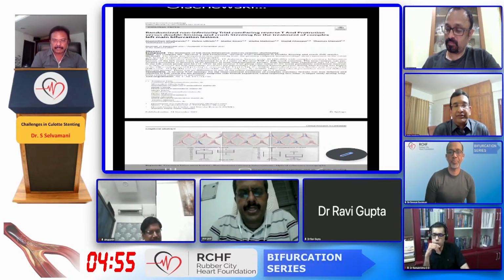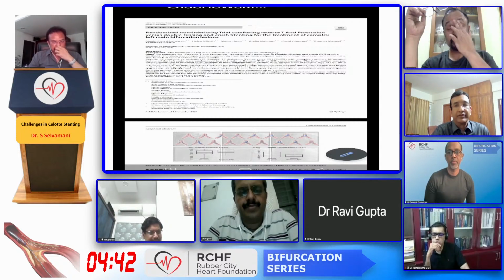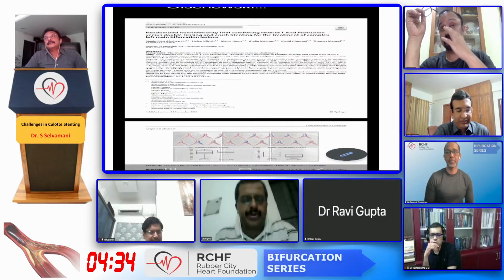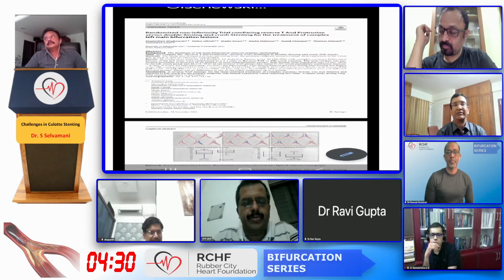But many a times in the pure ostial stenting, you find that you're never at the ostium. You always have many struts into the LMCA. And after a so-called attempted pure ostial stenting on the imaging, you find struts into LMCA. After seeing all this, do you intervene? If the patient is symptom-free, the other vessel is flowing, your pure ostial coverage was not there. You have struts overhanging documented on the imaging after your attempted ostial stenting.